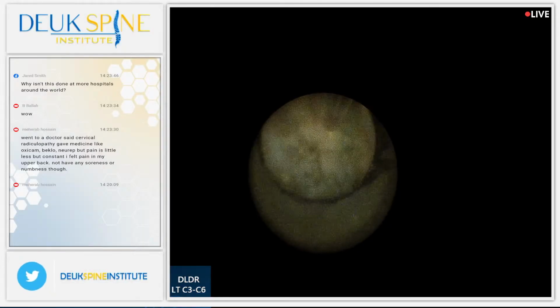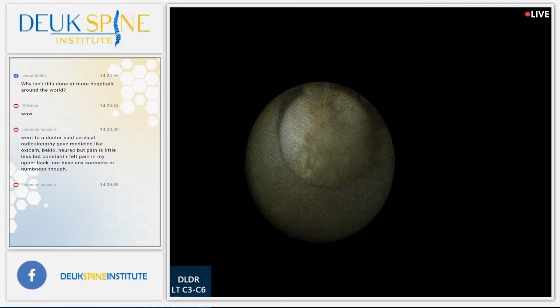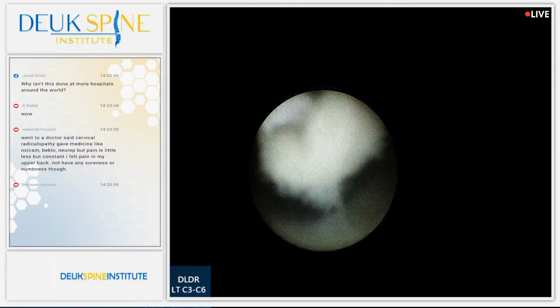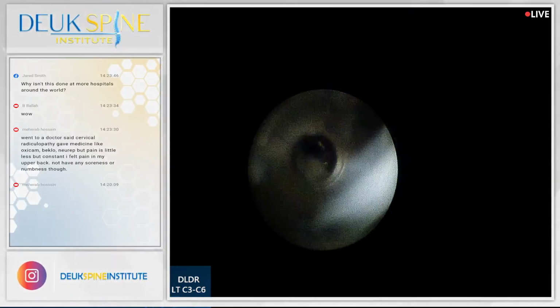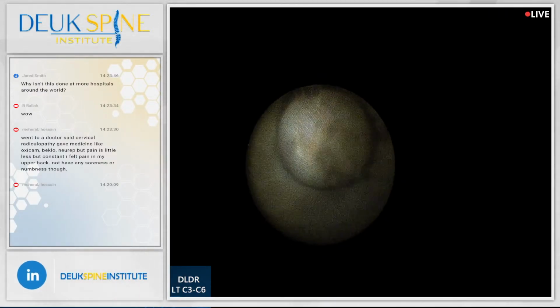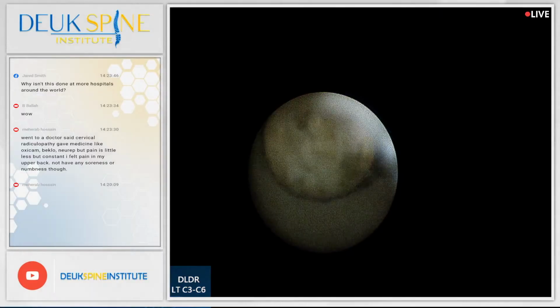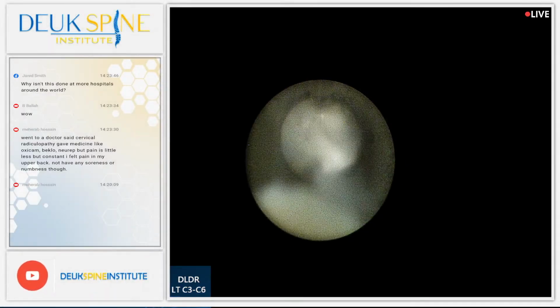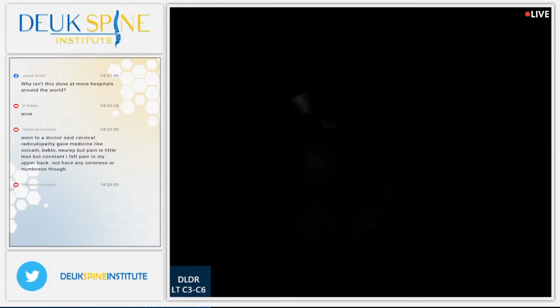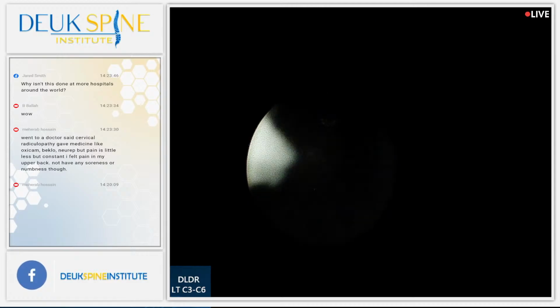But the worst place to figure that out is during surgery, right? These pieces of herniation should be gone. So, I want that machine. No problem. And do you know how to use it? No. Who's going to teach you? The technician, John. It's simple. You just aim to the screen and shoot it, and they tell you the watts. So you can tell how much is coming through. Correct. That's how they test the machine after they fix it. Oh, that's what we need. Damn these fragments. They just keep blocking my view.